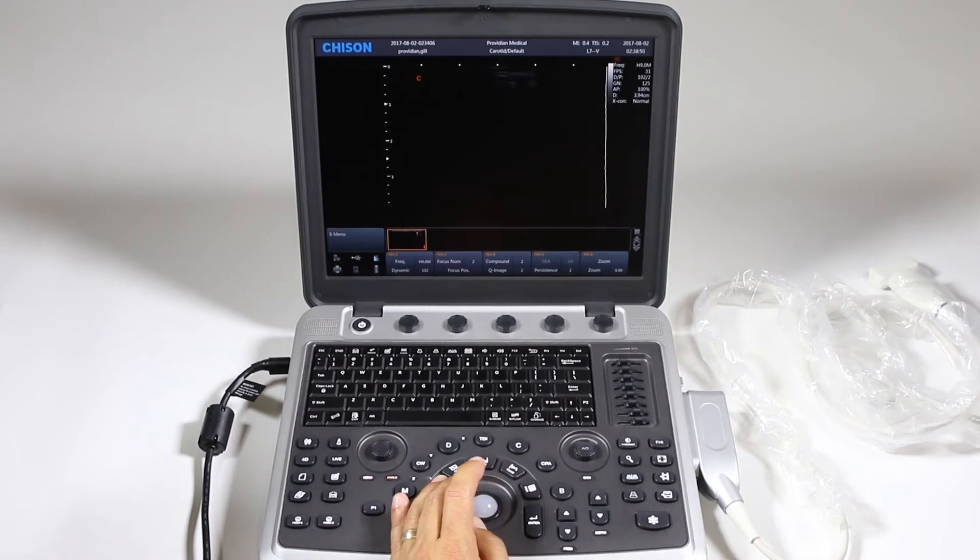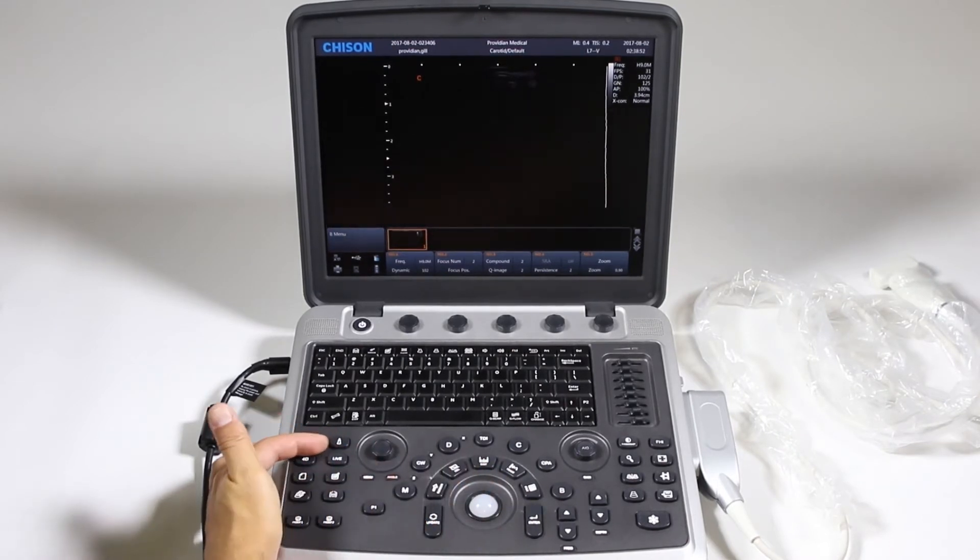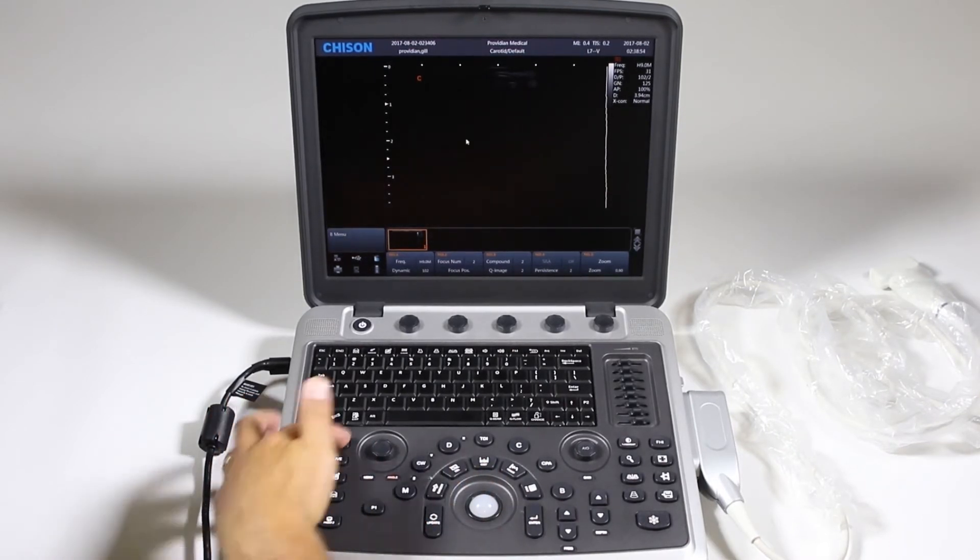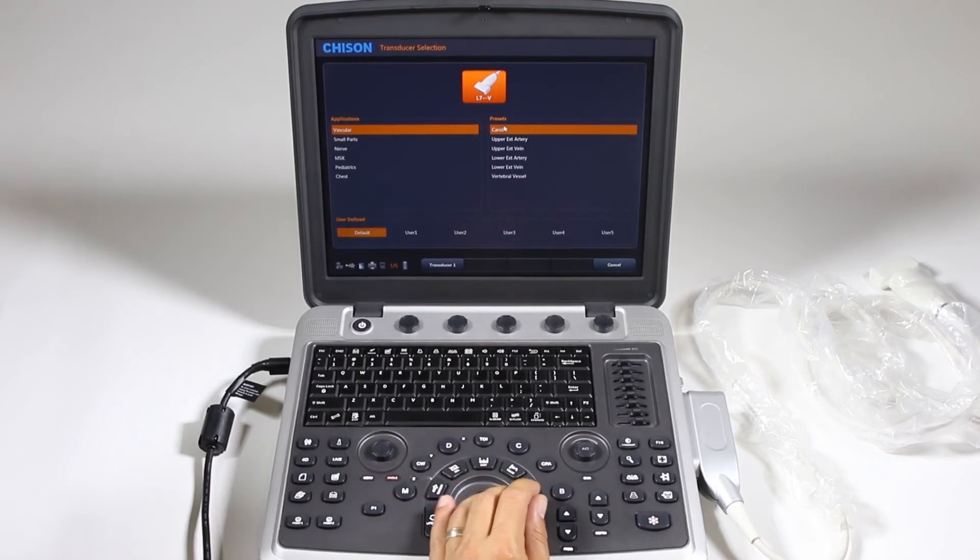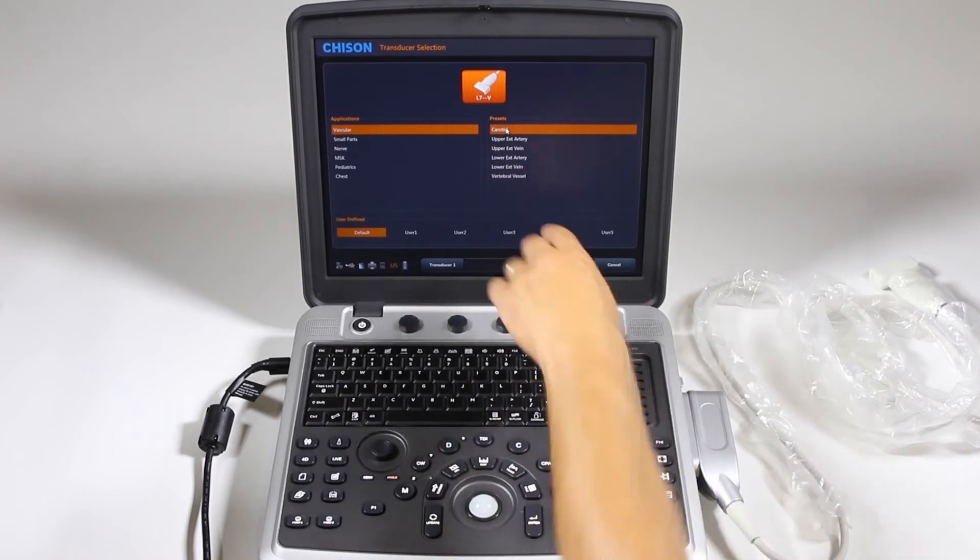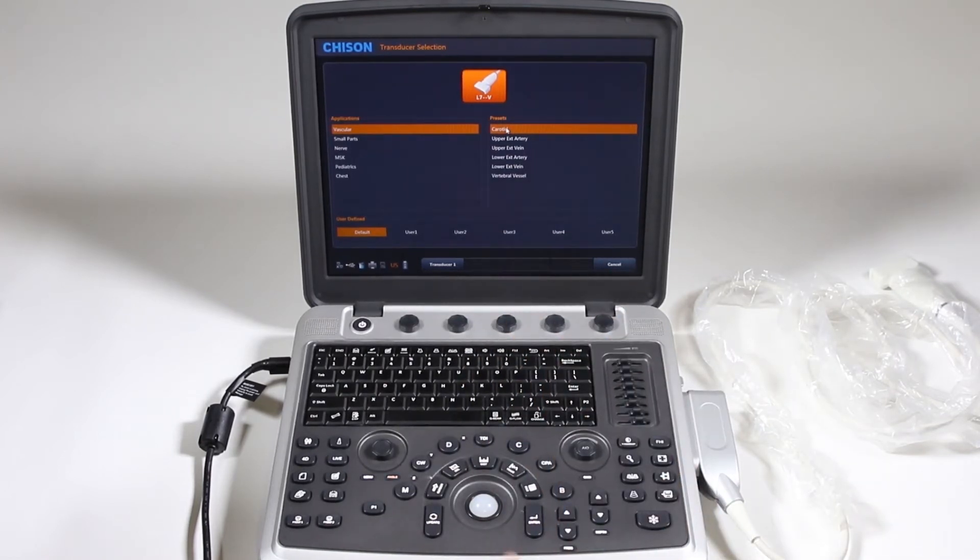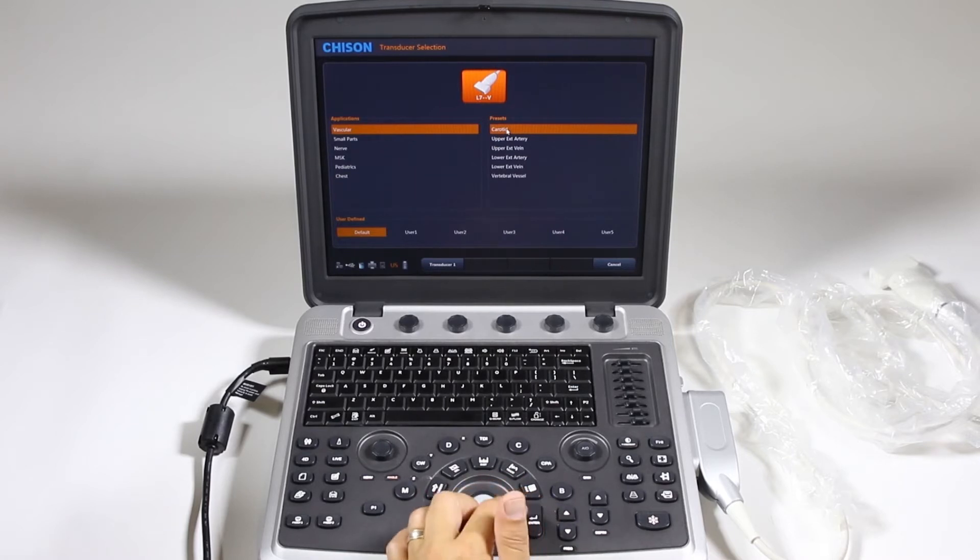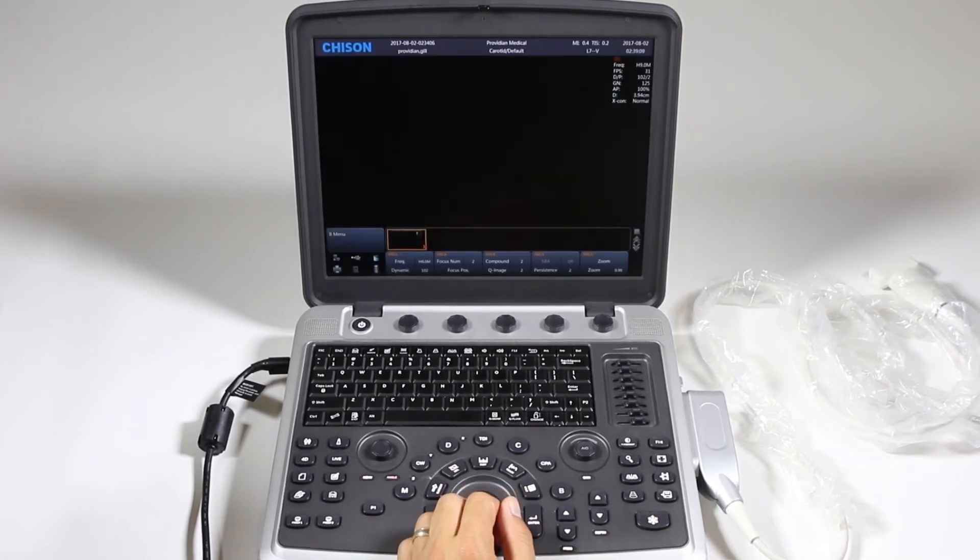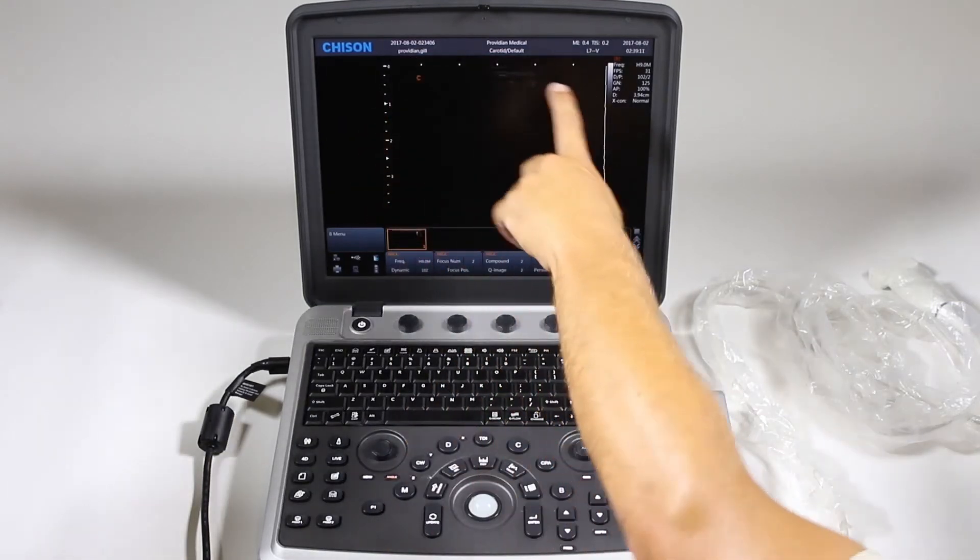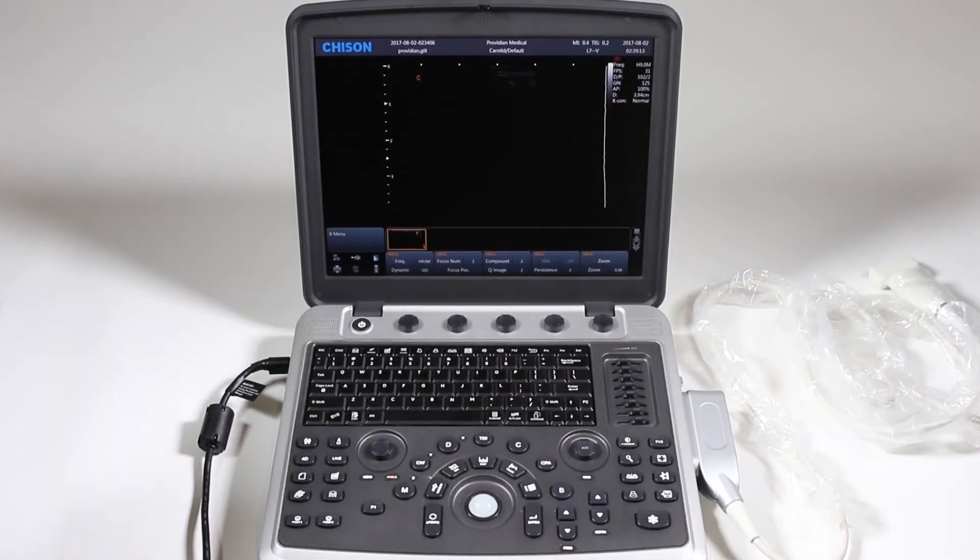Alright, so once we have this patient information done, we're going to go ahead and choose the next item, which is selecting your probe. We'll just choose vascular and carotid. In this case, you can do custom presets and those will show up and we'll show how to do that later in a later video. So in order to select it, we're just going to hit carotid and click it twice. Okay, so now we have patient information, carotid, and we're ready to go with the exam.